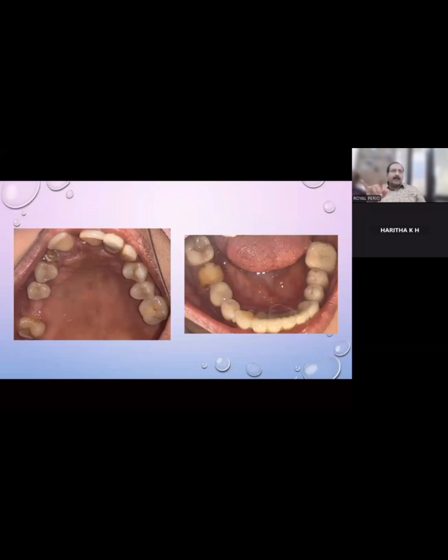So deep bite has to be taken care of, tongue thrusting has to be taken care of, plus this long FPD will have to be supported by enough number of implants as well. So the support of an FPD is from the implant bone interface, which should be increased. And the best way for increasing the implant bone support is by increasing the number of implants. Second would be to increase the diameter of implants. Third one, or the least choice, will be to increase the length of it.